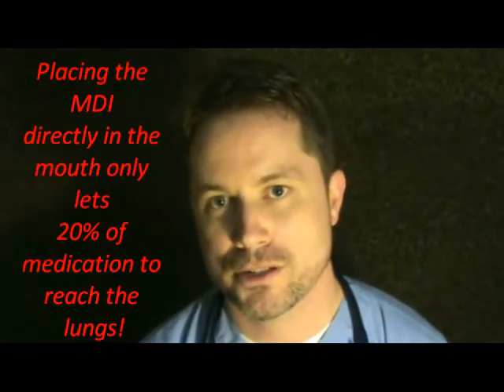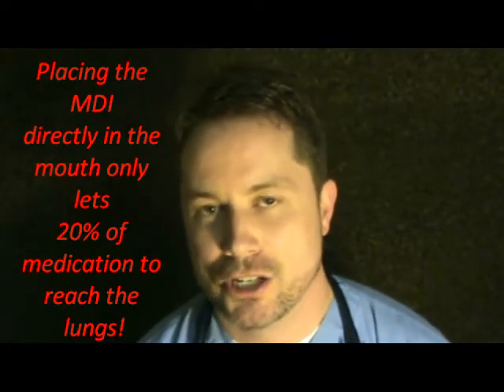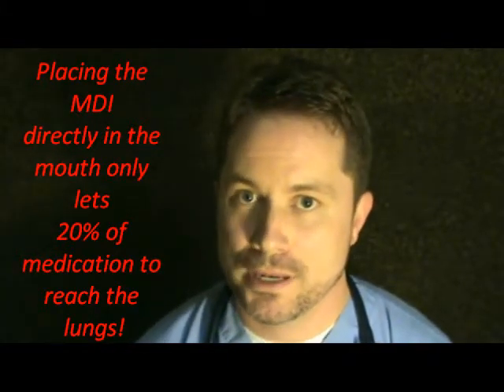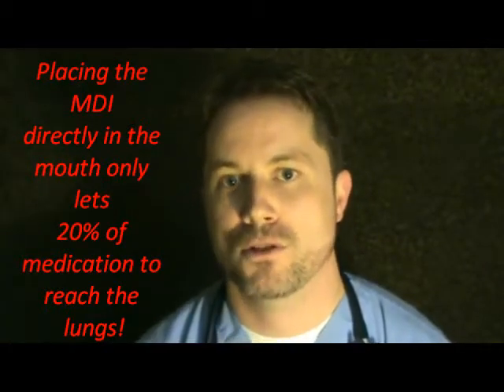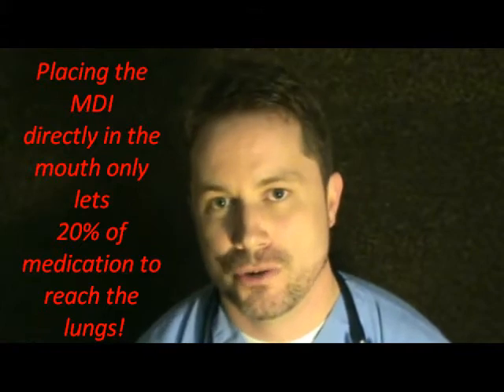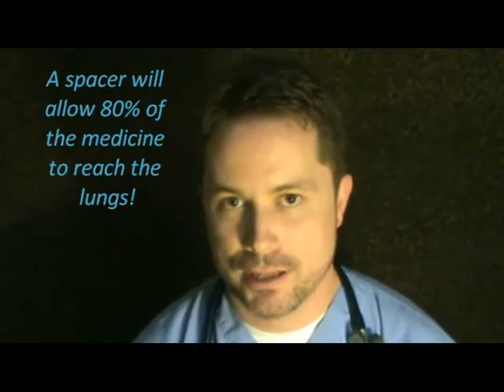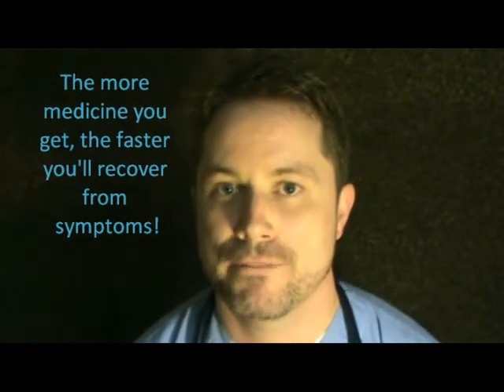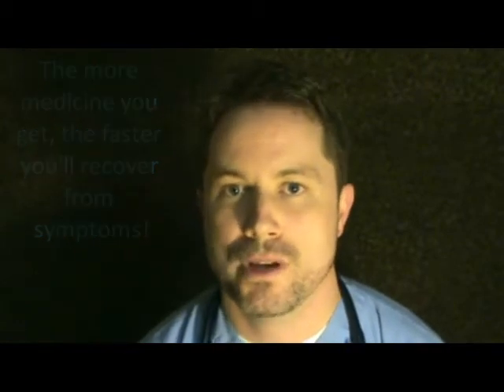Because if you don't use a spacer, if you just put it in your mouth and puff, 80% of that medication is going to bombard the back of the throat, stay in your mouth, and get absorbed into the bloodstream, where it's going to go to the heart and increase the heart rate, make you feel a little bit jittery. In children, it's going to make them hyperactive. Whereas if you use a spacer, 80% of the medication actually makes it down into the lungs. The more medication that makes it down into the lungs, the more effective the breathing treatment is going to be. The more effective the treatment, the quicker the recovery time.